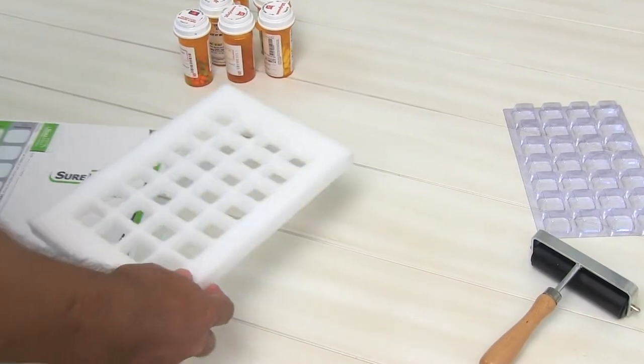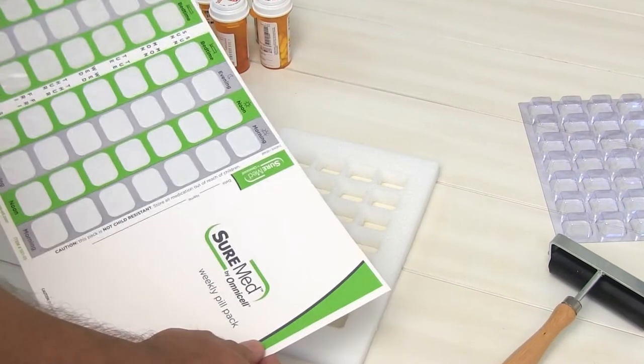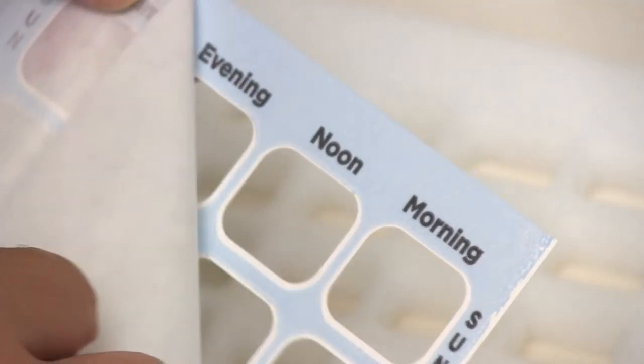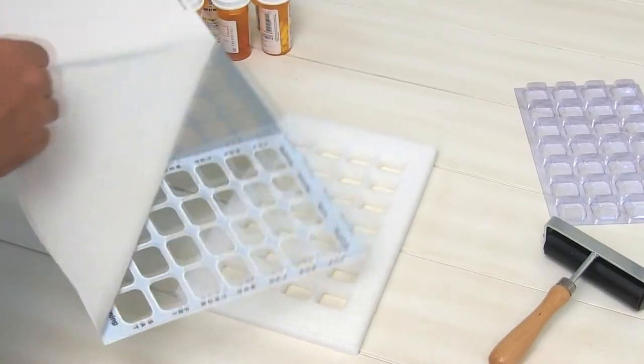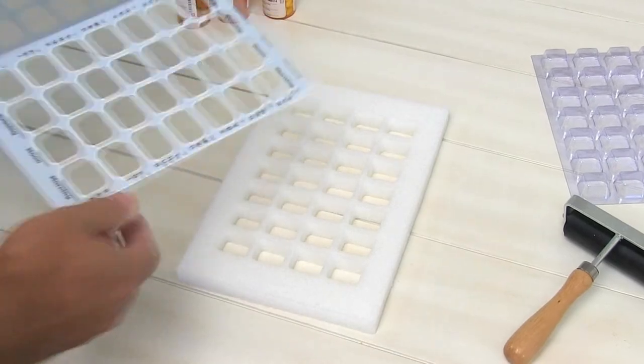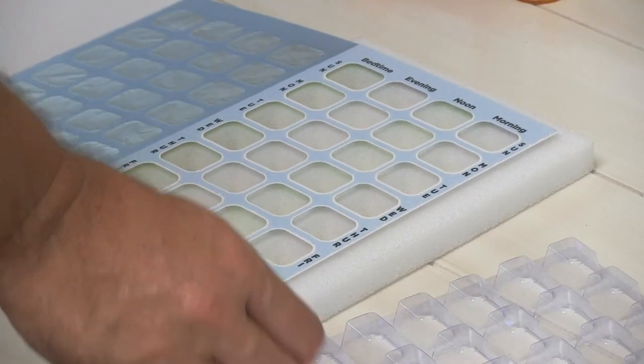Place the filling template on the table. Next, remove the pressure-sensitive liner from the bottom of the card. Place the card on the sealing template and insert the blister.